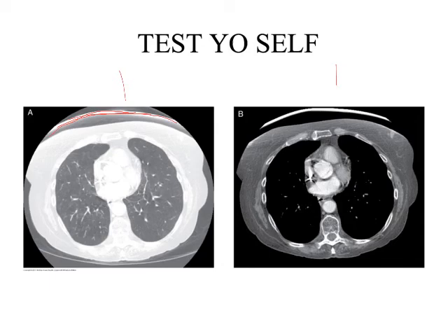But they've also clipped the breast, right? What do I mean by that? We have an area of view, right? So we have a display field of view, we also have a scan field of view. And in this case, I can't tell which it is without looking more in depth at this image. But I have clipped, for example, the breast over on this side. Do you see how I've just kind of chopped off a portion of the breast? It bleeds beyond the borders of the scan, right?